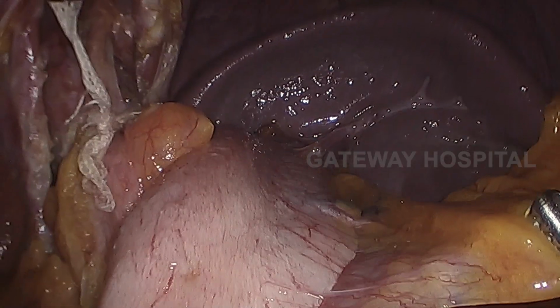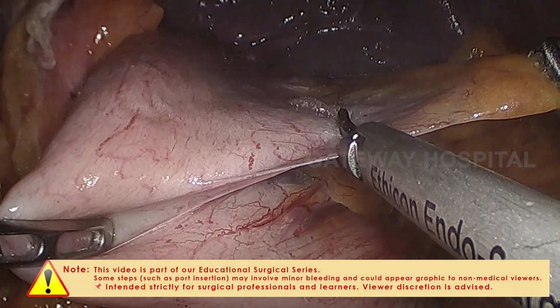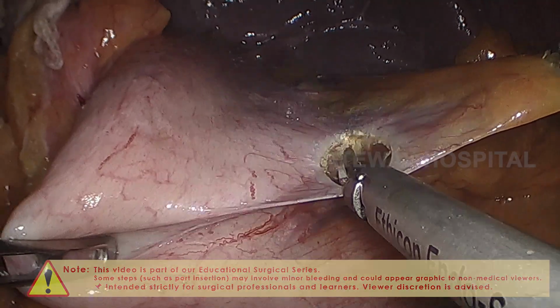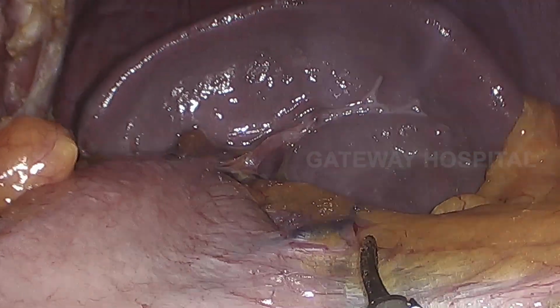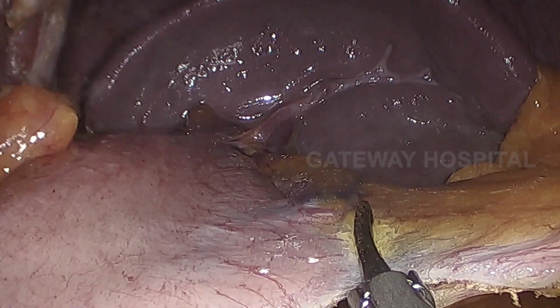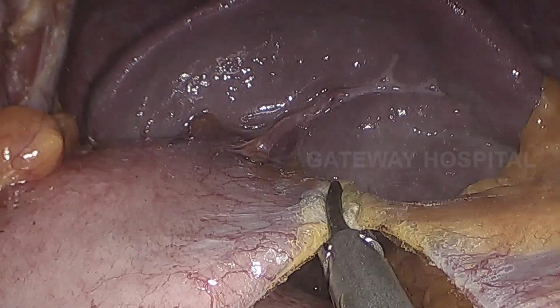After doing this, we divide few short gastric vessels in order to release the fundus so that it will be used for posterior 270-degree Toupet fundoplication.